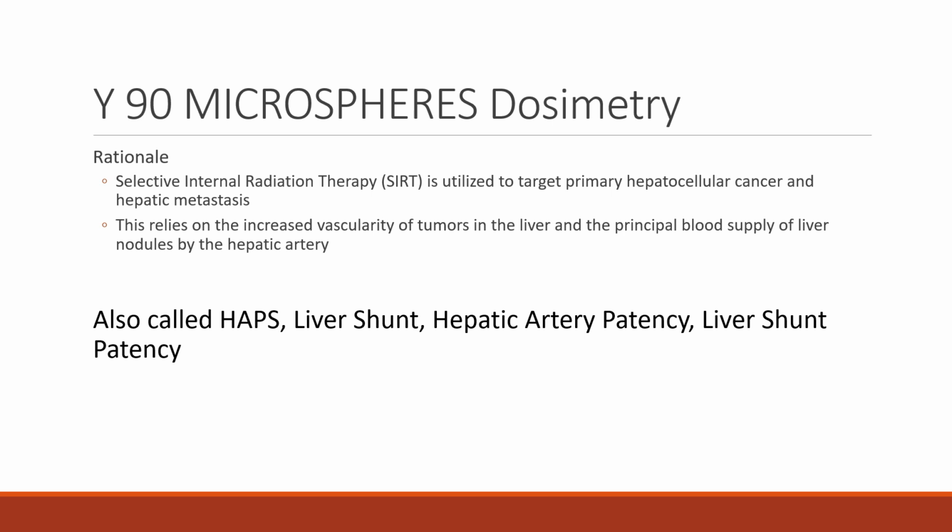Now, when you're administering this, this is often done in a fluoroscopy suite. And sometimes radiation oncology wants to not include nuclear medicine. They want the radiation therapist or the fluoro tech to inject or to handle the microspheres, because it goes into a shunt, but they want the radiation therapist or fluoroscopy tech or somebody to handle the dose.